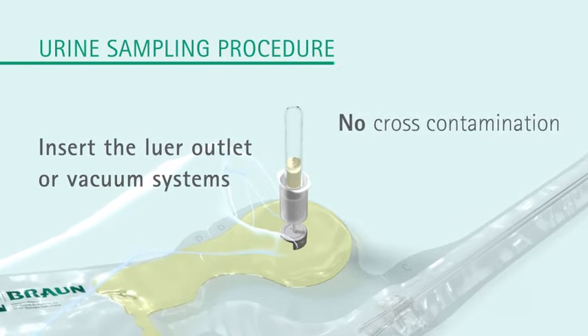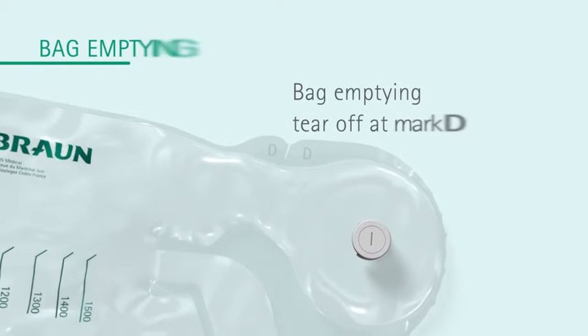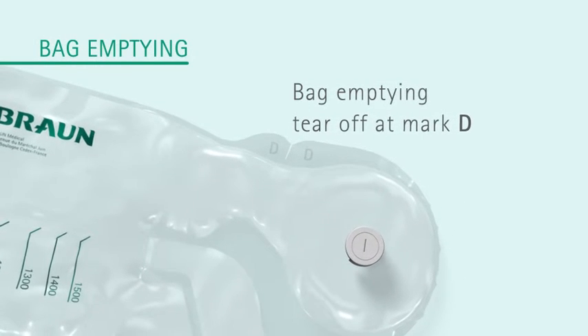The urine sample is ready for urine analysis. To empty the bag, tear off at mark D.